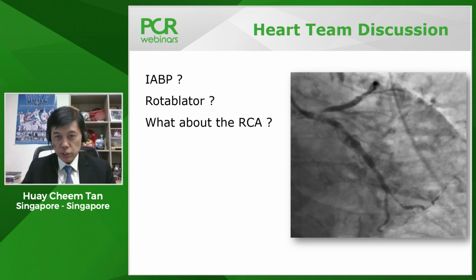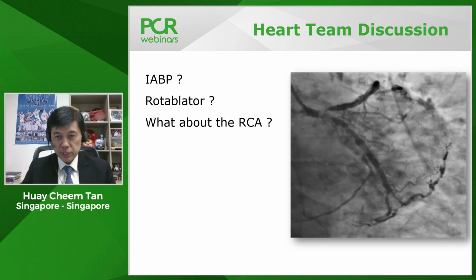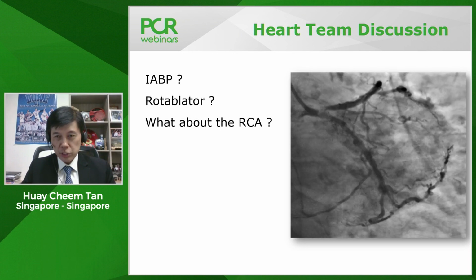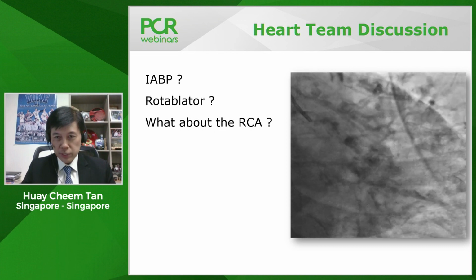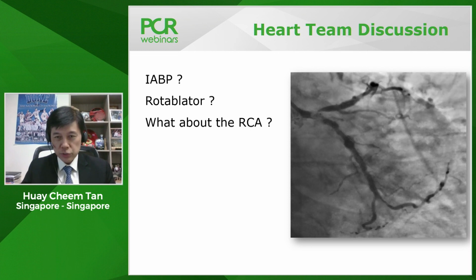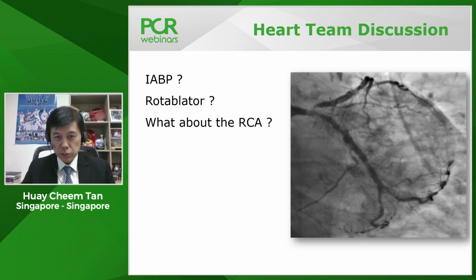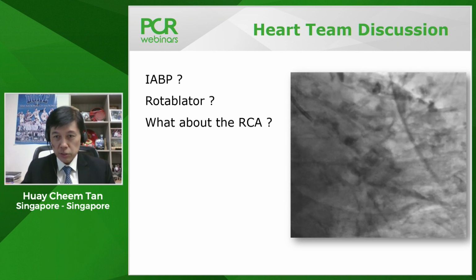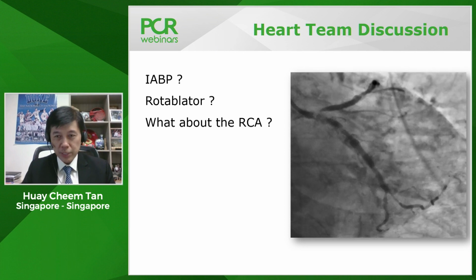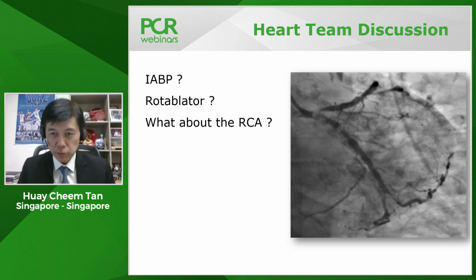With regard to the use of devices for lesion preparation, I would consider some form of imaging to help me in deciding on the strategy. Imaging will tell me what sort of lesion I am dealing with. Is this a concentric calcification, or is this superficial or deep? Because it's going to help me decide on what sort of lesion preparation and devices to use. Plus, IVUS or any other imaging is going to be helpful in optimizing results. So I would do the left main first and image, followed by strategy.